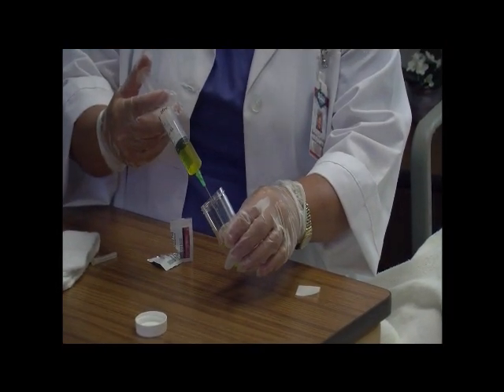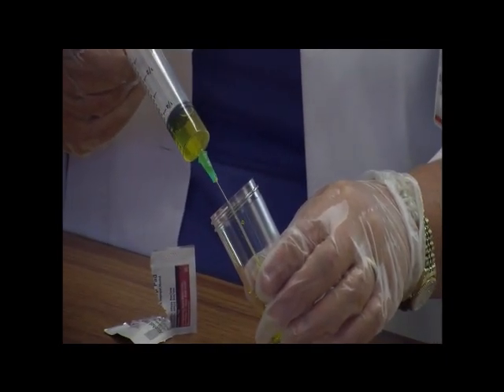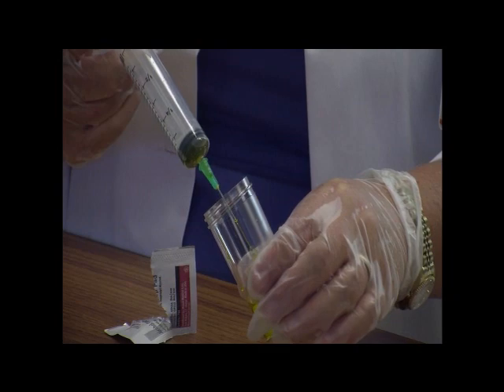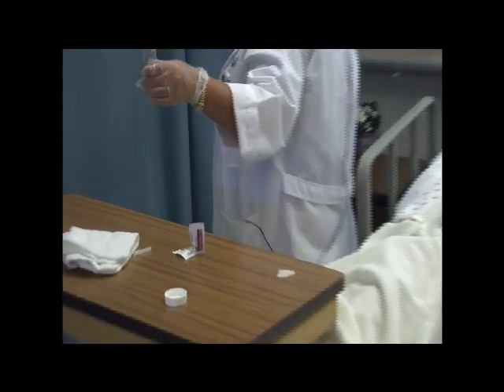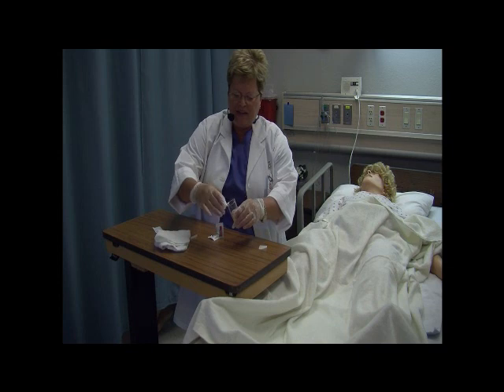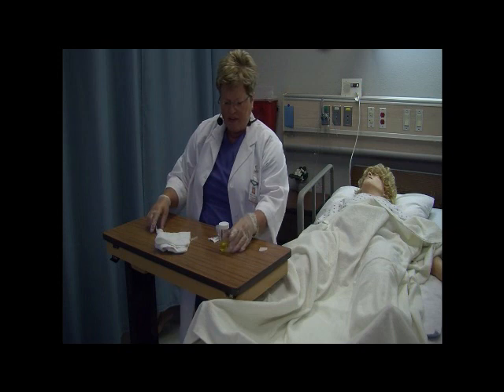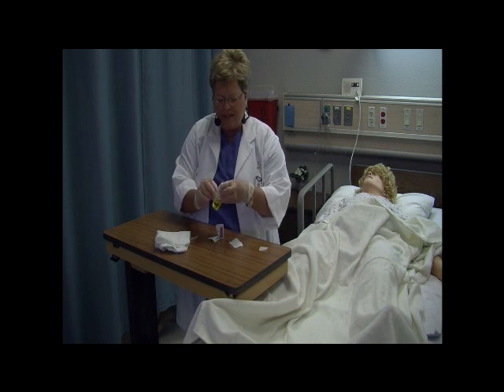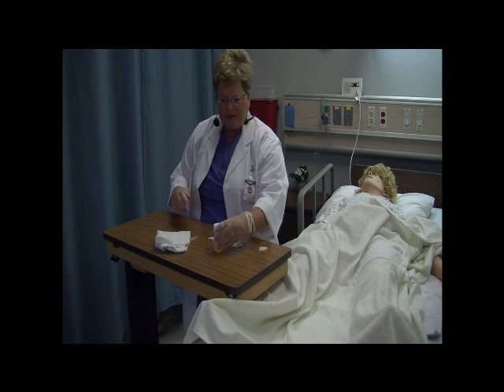Do not allow the needle or syringe to touch the cup. Do not pass anything over the top of the cup. Press slowly so that it does not splatter. Discard the syringe and recap. Pick your cap up from the side, taking care not to pass anything over it. Secure the lid. Fill out the label and attach it to the bottle. Place this in a small clear biohazard transport bag and transport the specimen to the lab.